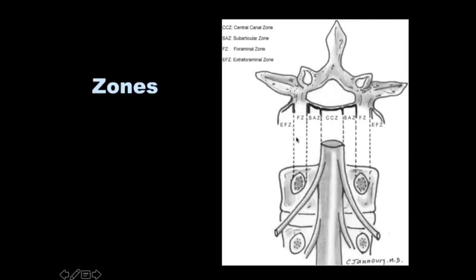When you're describing the zones in the degenerative spine, you have to be very particular as to where the nerve is getting pinched, because that will have an impact on what level the surgeons would be operating on. The other thing is that there can be a nerve which is getting pinched at a higher level, so it might be the L5 nerve getting pinched at a neural foraminal level, or higher up at the level of the central or the paracentral zone. That's something that needs to go into the report.